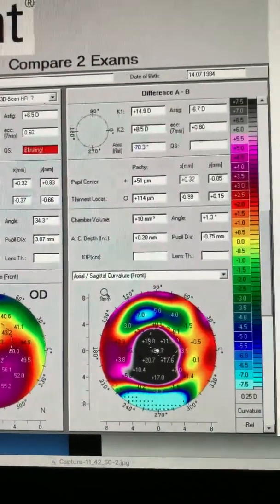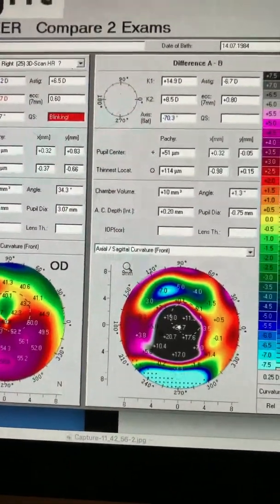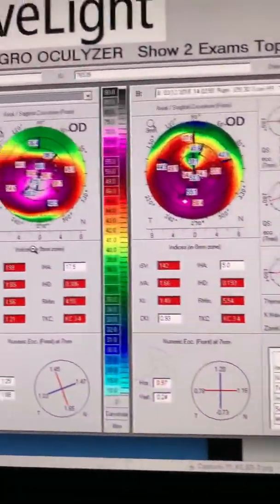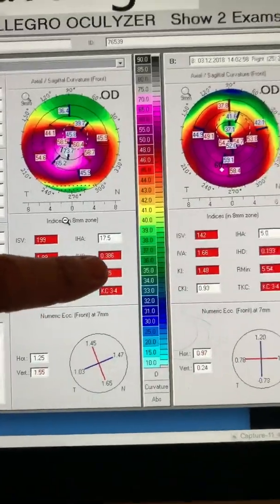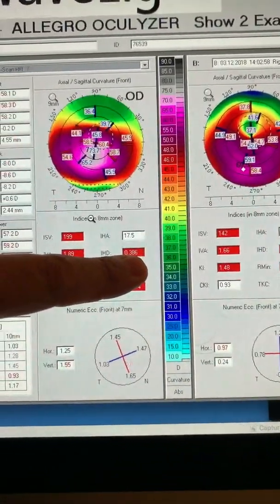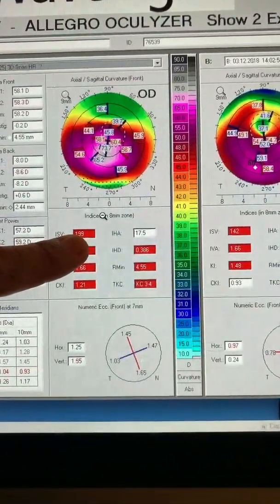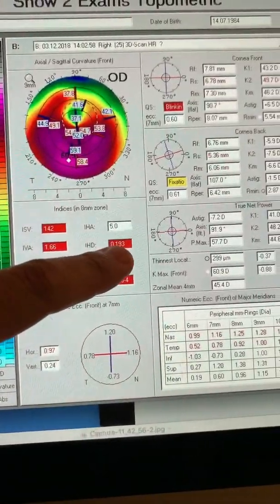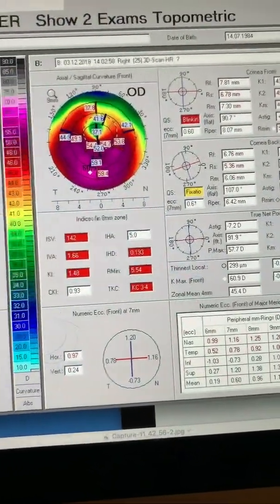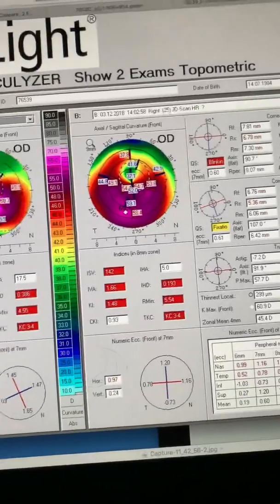Let's go see the difference maps on topometric indices. We can see why this improvement, we went from an IHD from 386, ISV 199, extreme numbers, to 193 and 142. Obviously, the secret here is that this was a very central cone.